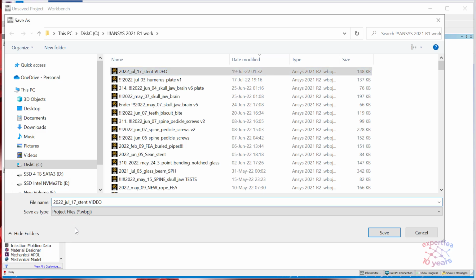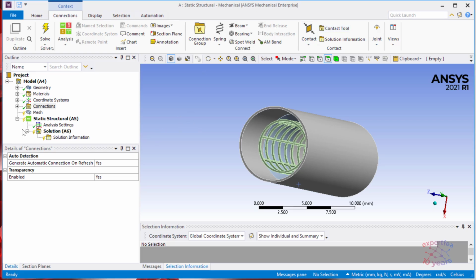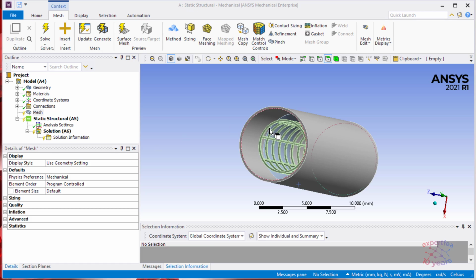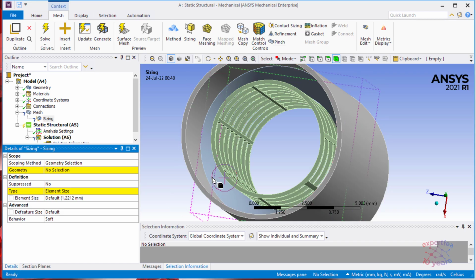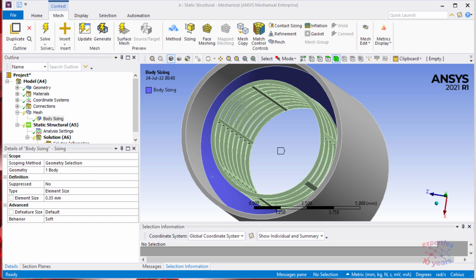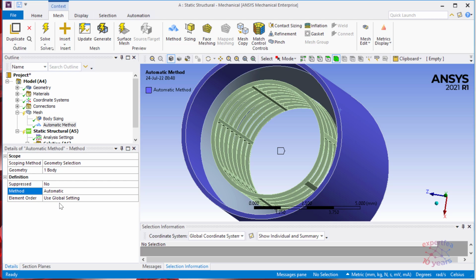A few days have passed, so we'll write here 24. Minimize, and we're back here. So regarding the mesh, let's assign an element size on the plaque underneath inside the blood vessel. Now let's ensure that this vessel will not be modeled with hexahedrons. So method tetrahedrons.